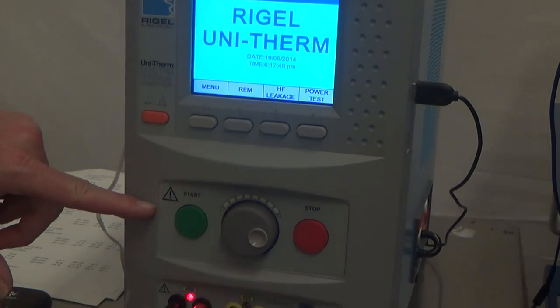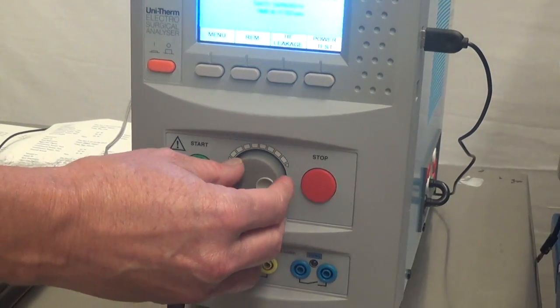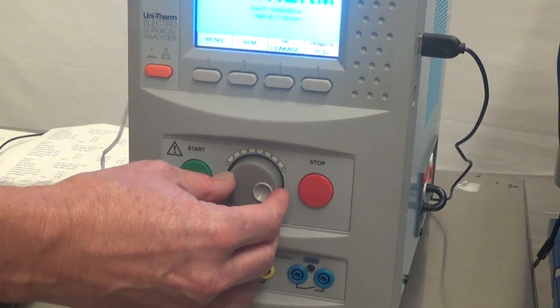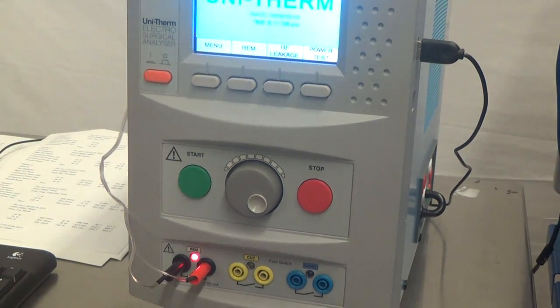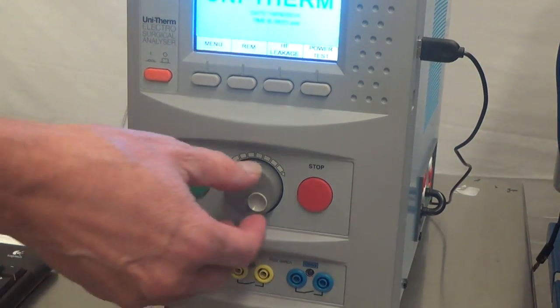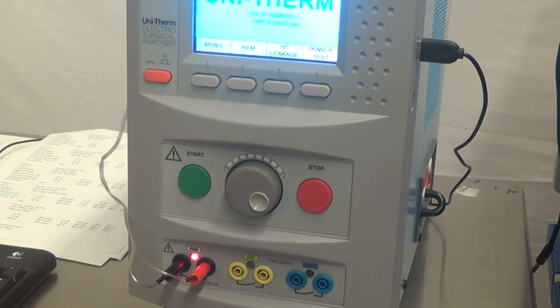Next, we have the start and stop button and the trim button. This trim function, you press in and you turn, and you can do a variety of functions. It functions like an encoder that turns you to go up and down.